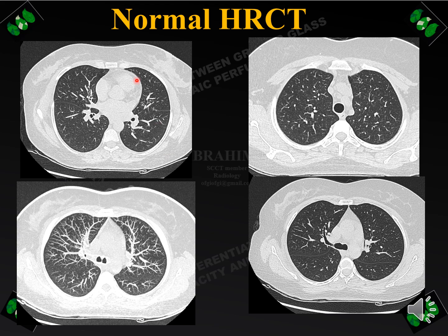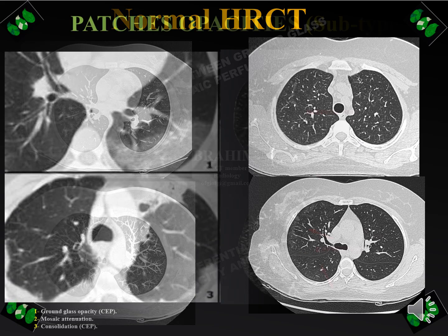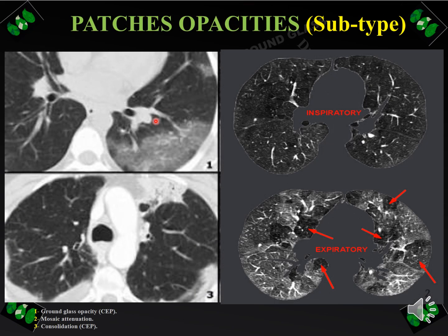As we see here, the normal HRCT should show a symmetrical, homogeneous lung parenchyma, as seen on both sides and in each lobe of the lung. Comparing with this abnormal lung, which shows areas of low attenuation — the black area — and areas of high attenuation — the white area — in these features.